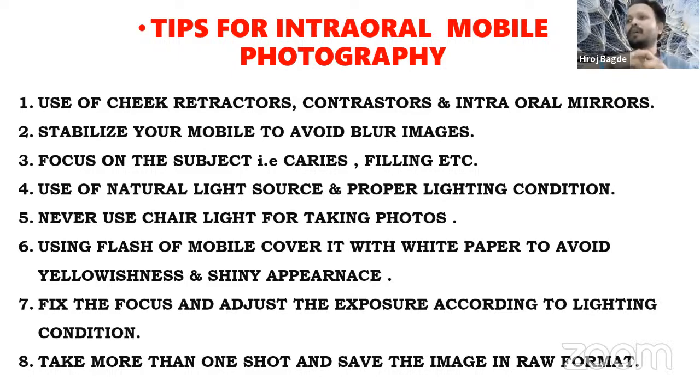Blur comes when you use a mobile. Your mobile should be so stable that this blurring of the image is avoided. Then we focus on the subject.